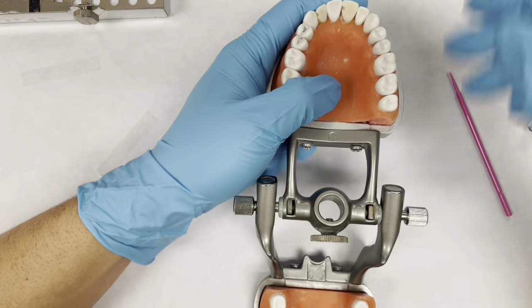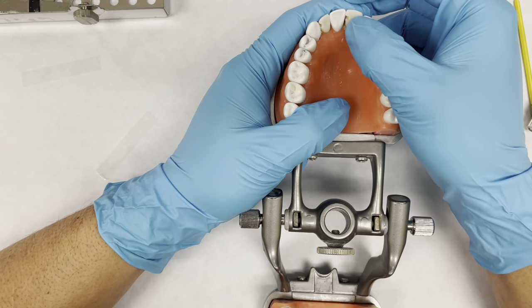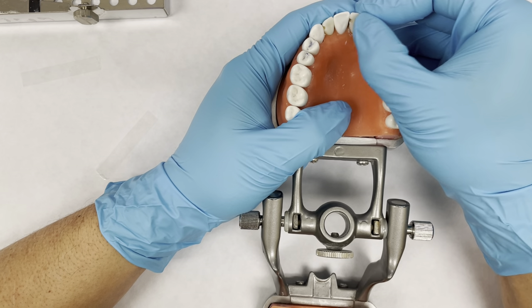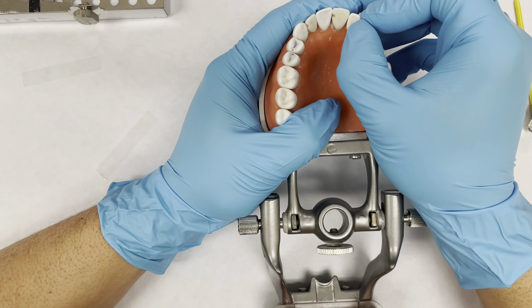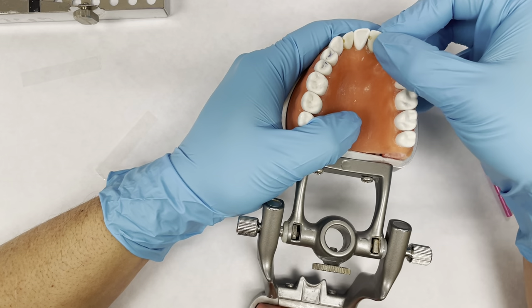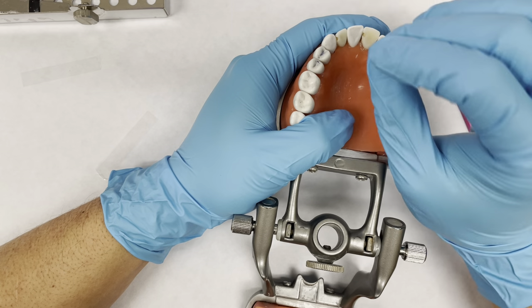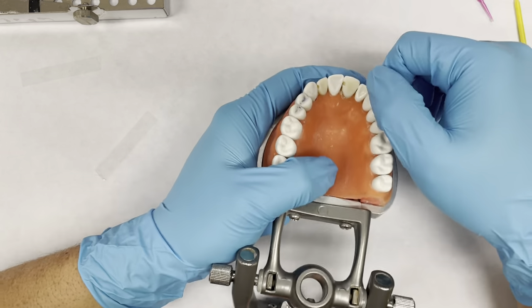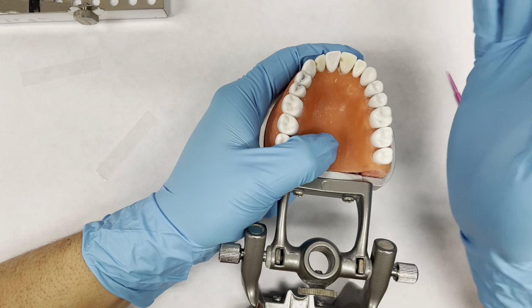When working on the anterior portion, you're going to have to know your measurements. For the centrals, make sure that you are 1.5mm from the DEJ. For the laterals, as of 2022, you're 1.25mm from the cavosurface margin. Sometimes the DEJ can be kind of hard to see, so if you wet it a little bit and then dry it just slightly so it's kind of wet inside, it'll make it easier to see the DEJ — that enamel-looking spot before the dentin.